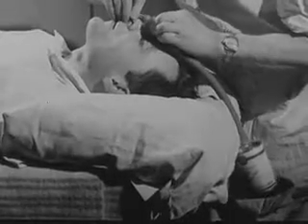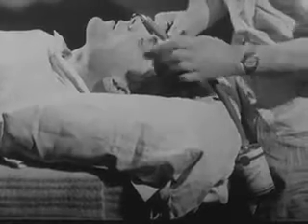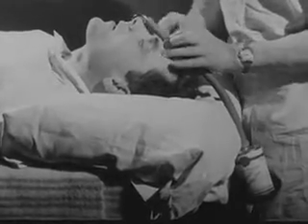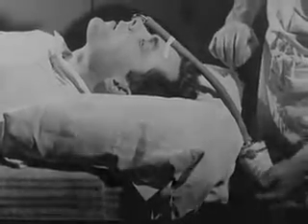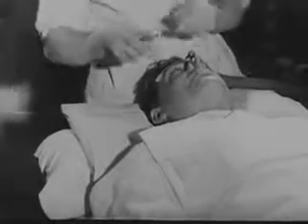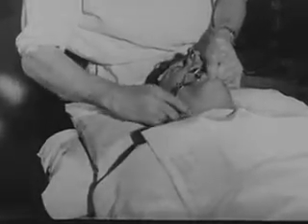A further alternative is Flagg's method, used in the same way as with oral intubation. The throat can be packed with gauze as in oral intubation in cases where there is any chance of blood reaching the larynx.